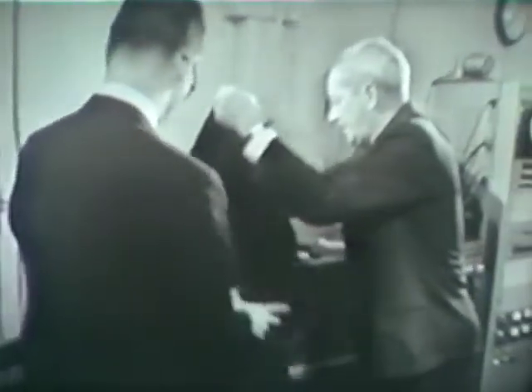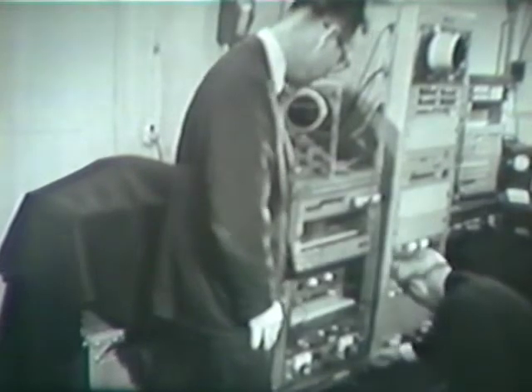Yes, I'm going to cover this up because there's quite a bit of light in here. This little box is not completely light tight. All right. So let me turn on the scanner. Switches 9 and 11. And come on over here a second, John.